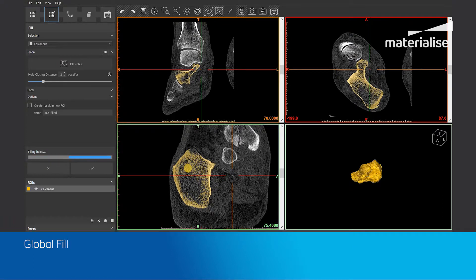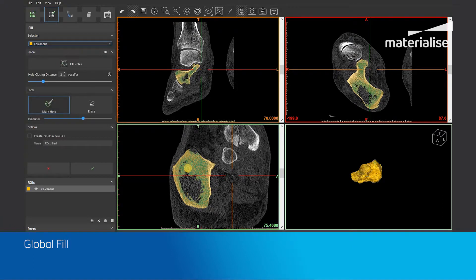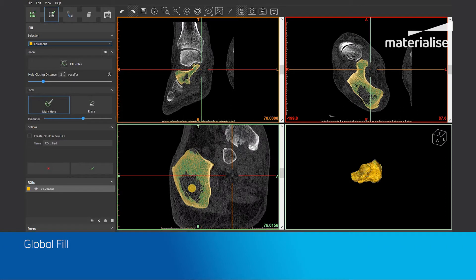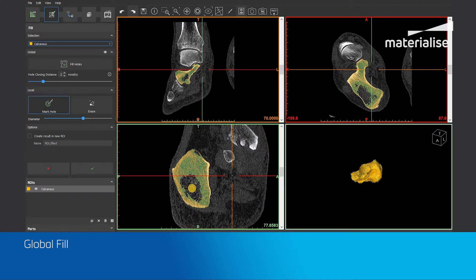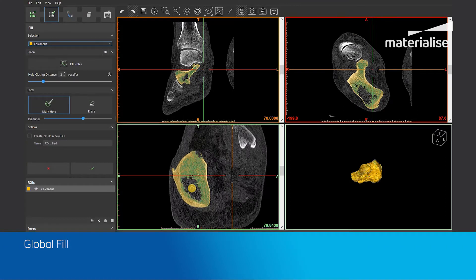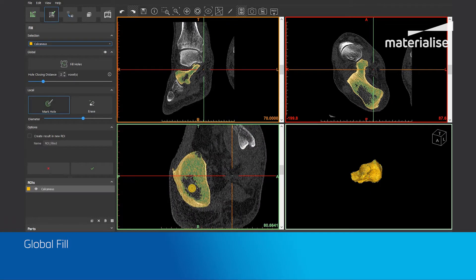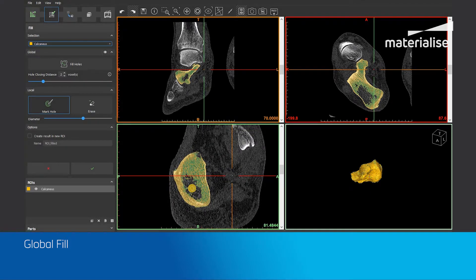The global fill will look at the entire input region of interest in three dimensions. It will first try to close holes based on the hole closing distance parameter and then afterwards fill up the holes that are closed. When the operation is done the result is shown in green so that you can easily see what was added to fill up the region of interest. In this case you can see that the entire region of interest has not been filled up because there is too much information missing to be able to fill up the holes correctly.